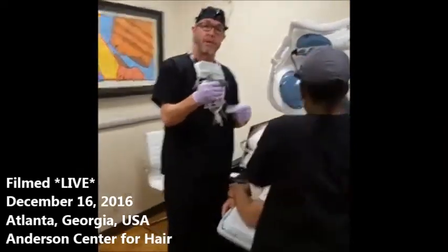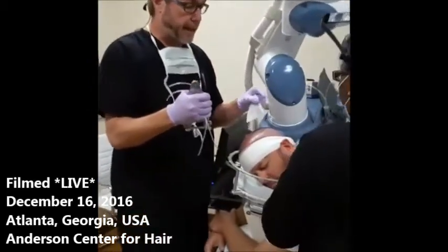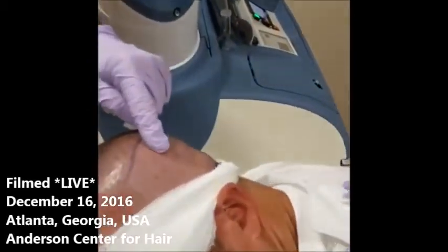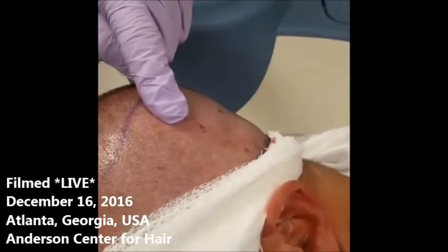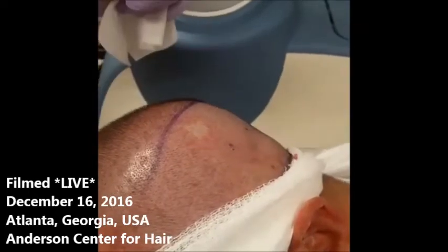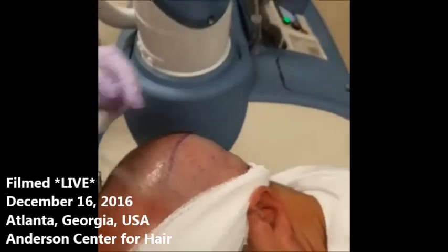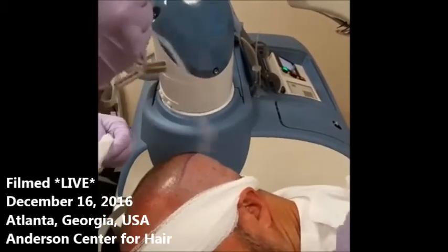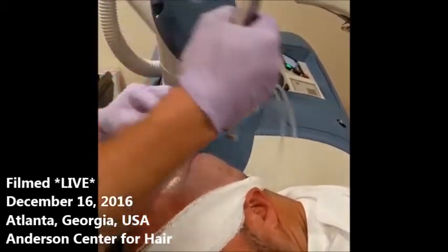Come on a little closer and have a good look at the scalp here. It's a nice rosy pink, and you can see when I press my finger on it and take it off, it blanches for a second. After I place this tensioner, it's going to be blanched on the inside as a result of the tension placed by the tensioner.